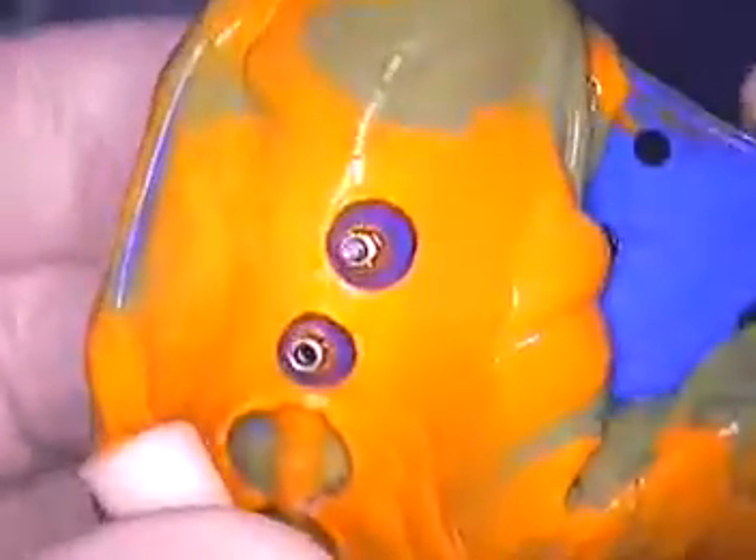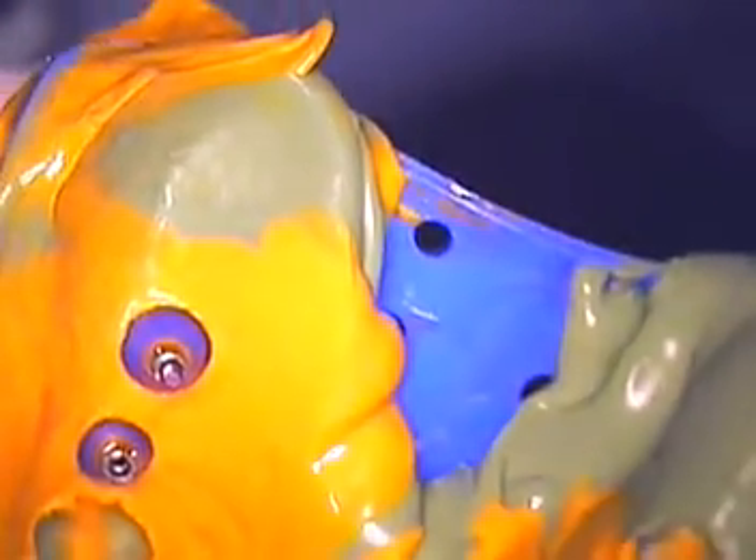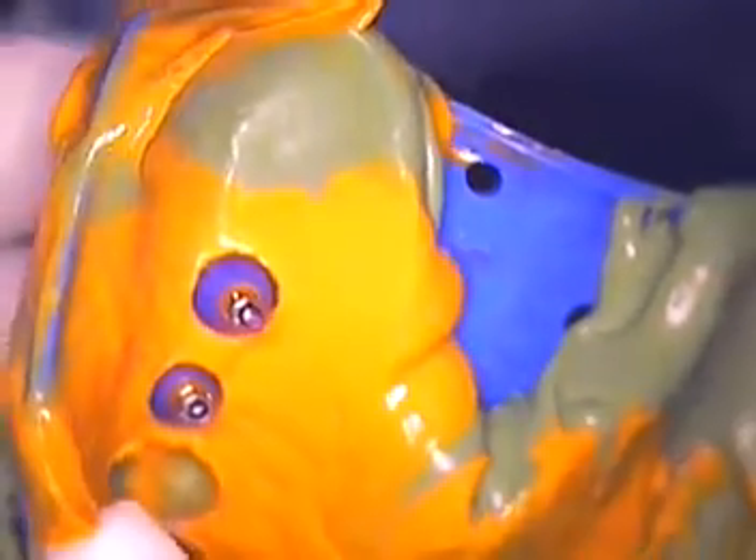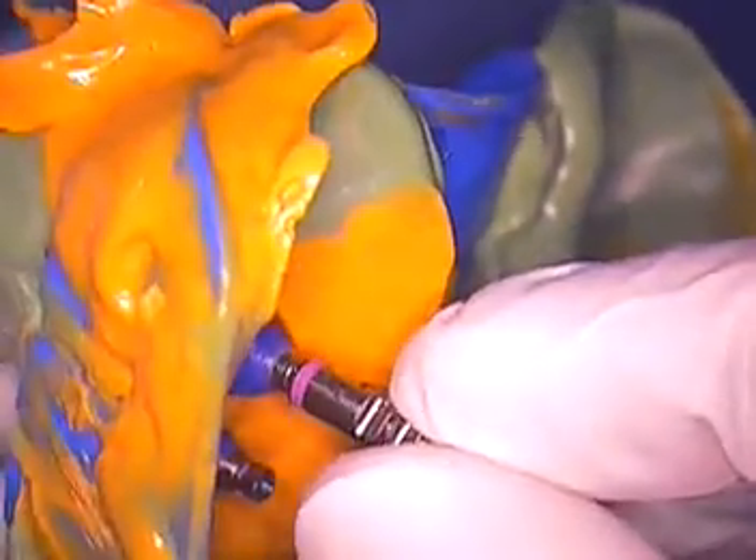Now, imagine three-dimensionally through this impression. There's that bar that I showed you. Now, see these screws — how they pop out — and of course, then you place your analog on top of that. I have some used analogs here. I'm not going to use them with the case, but I'm just going to show you how this gets pushed into place. And then you screw that in place tightly.